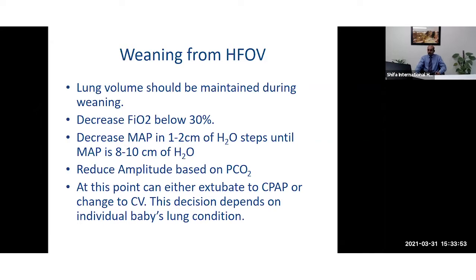But in some cases, if we think that the baby's lung condition has improved significantly and the baby does not need to be on the ventilator anymore, there is a possibility that some babies might be extubated directly onto CPAP from high frequency ventilation. But that again is a decision which depends upon the individual baby's lung condition. Most babies will be stepped down to conventional ventilation first.